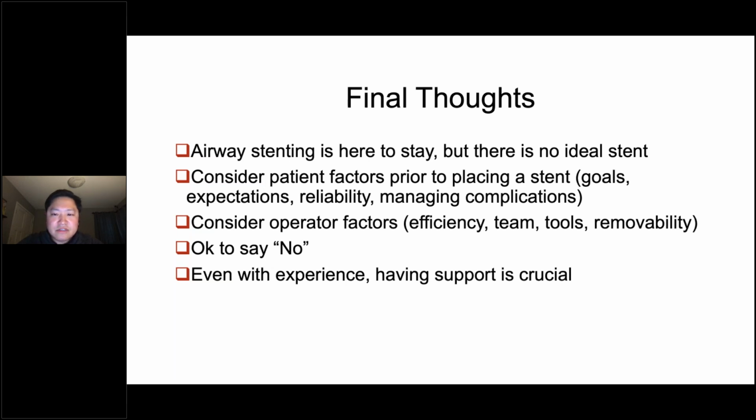I think technology and the epidemiology of airway disease are transforming this area, and hopefully there will be better stents that are better tolerated by our patients. You consider patient factors prior to placing a stent, so the expectations, reliability, and managing complications.